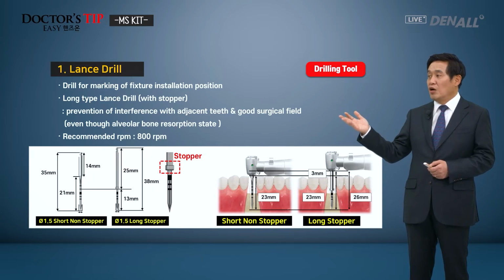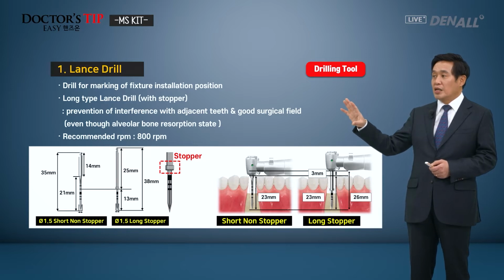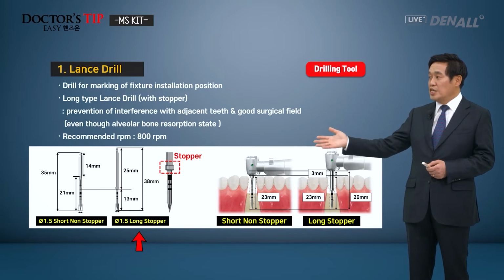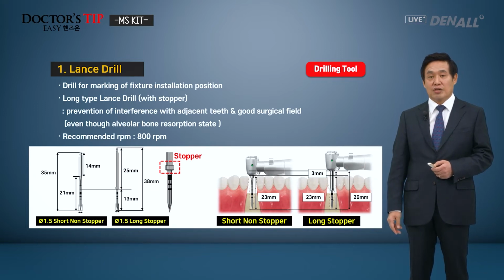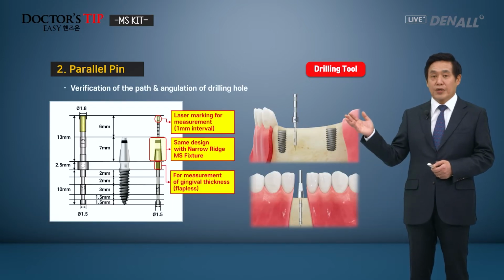So we have two types, a short non-stopper, and also a long stopper. So it's a longer version. If you drill, you can go up to 26 millimeters, so there will be no interference from the adjacent teeth. Next is the parallel pin.